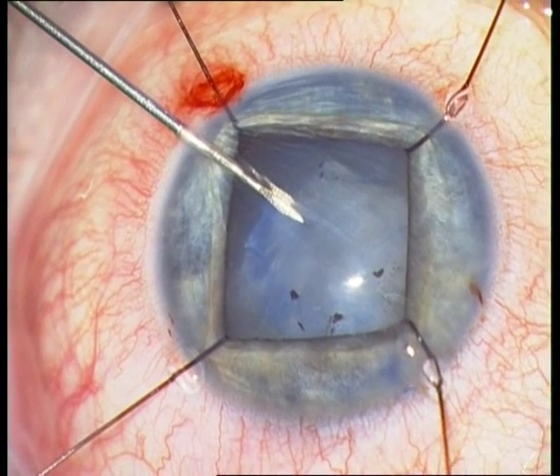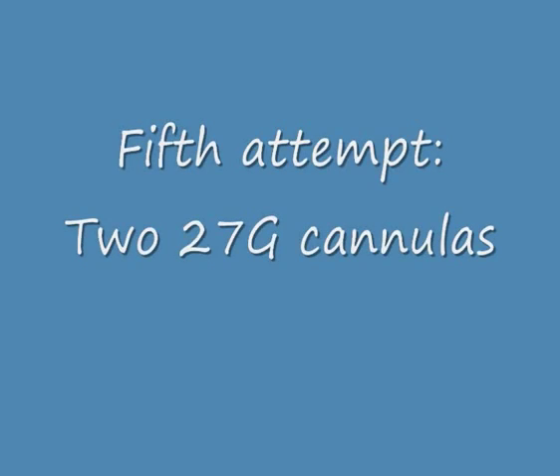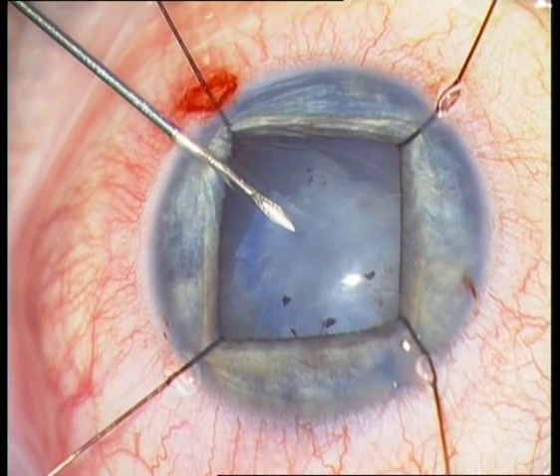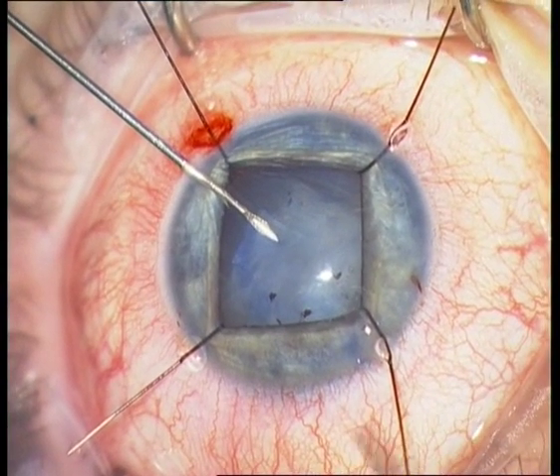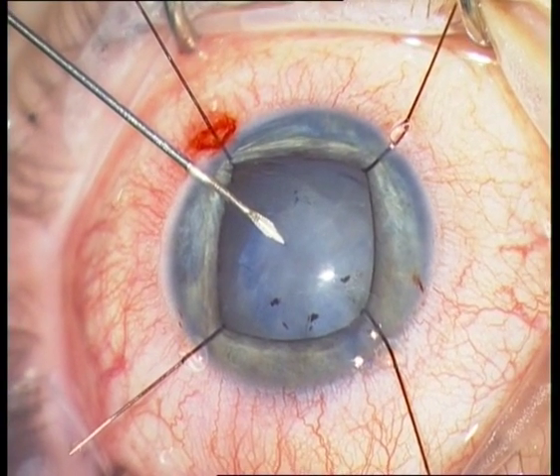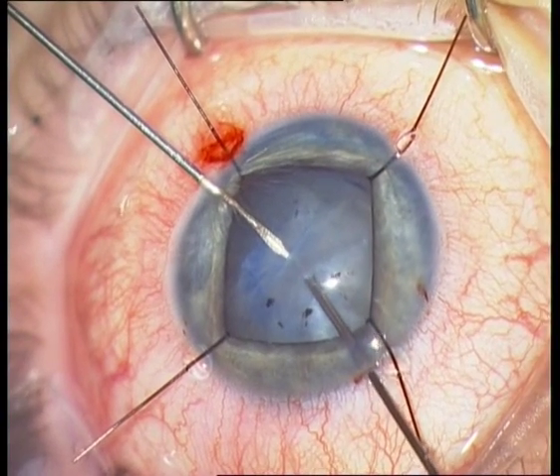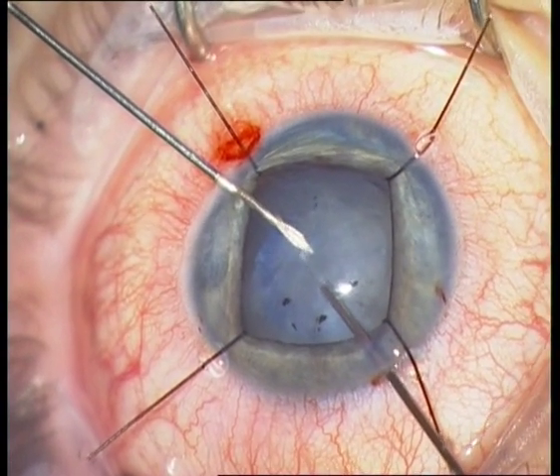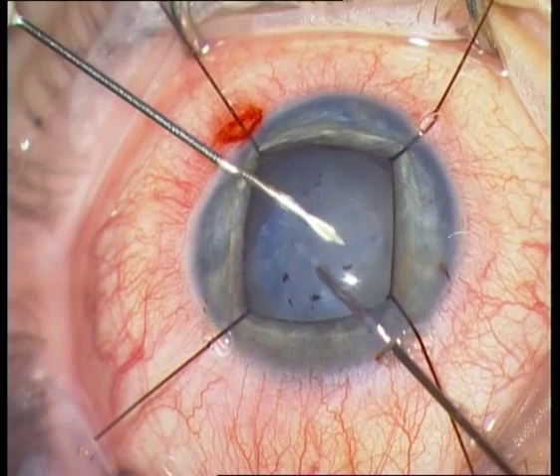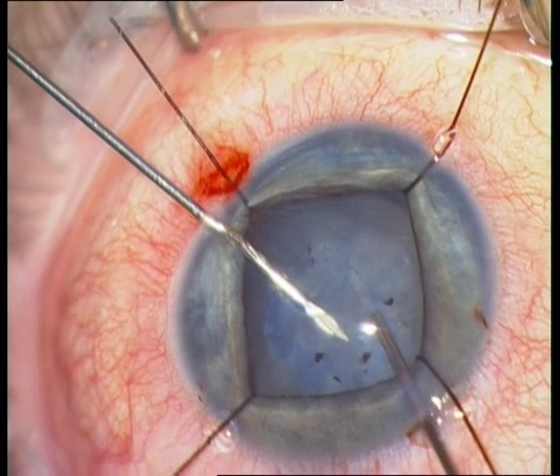The final attempt is the usage of two 27-gauge cannulas, which I insert from both sides of the cornea, and now I succeed to open the anterior capsule and create a hole inside the anterior capsule.